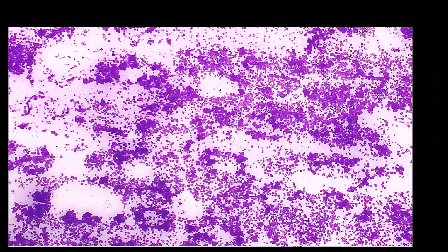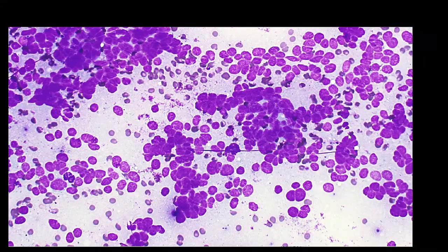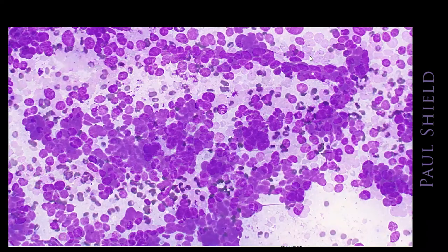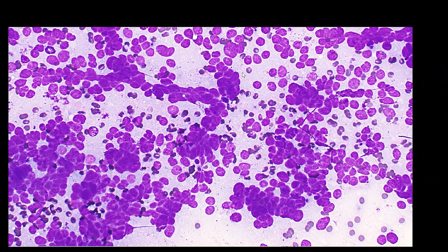They're not looking organised like adenocarcinoma because they're very tightly packed. So it's a very high NC ratio. You can't really see cytoplasm around the cells at all, and they're like very sticky nuclei all held together. Notice how they're forming trabeculae or linear arrangements here as well. There are quite a few single cells around. There's probably more variation even in this size than one would normally see in lymphoma as well.